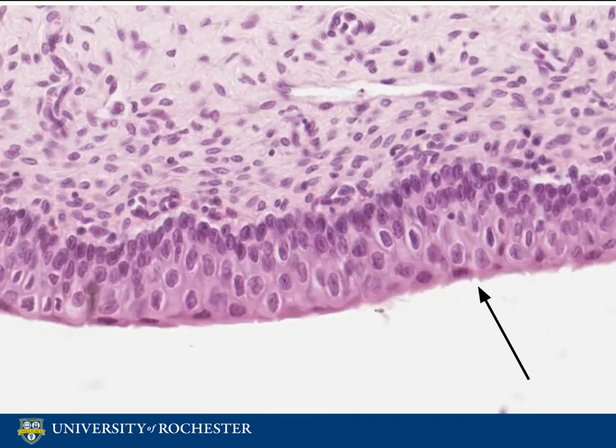The innermost part of the urinary bladder is the mucosal layer, which is lined by a transitional epithelium — the urothelium — as indicated by the arrow. When the bladder is relaxed, the epithelium layer appears to be made up of rounded to cuboidal cells. You may see special urothelial cells known as umbrella cells along the surface of the bladder epithelium, which have ample eosinophilic cytoplasm and often two nuclei.